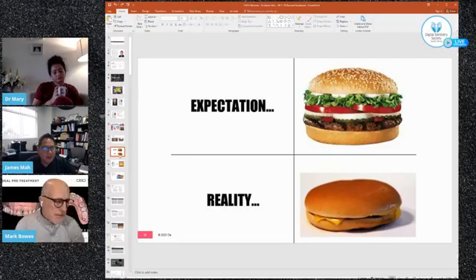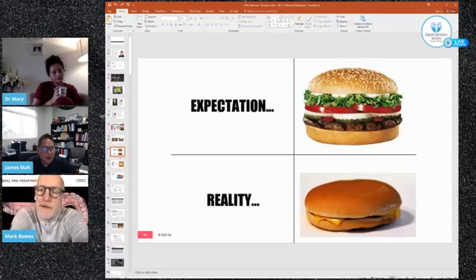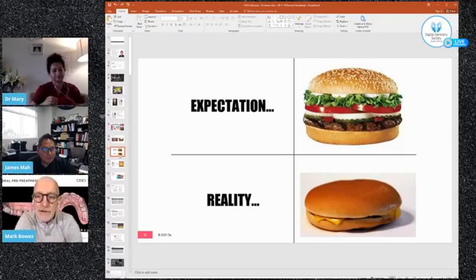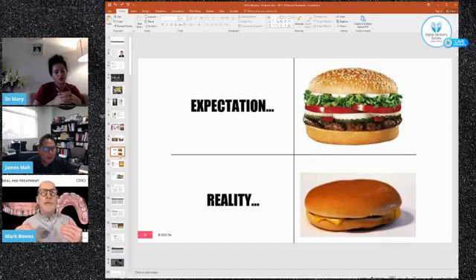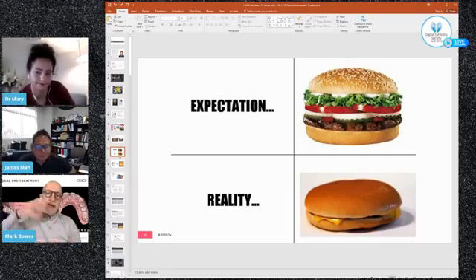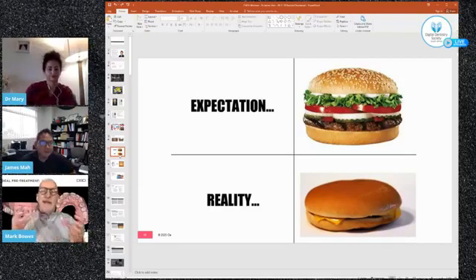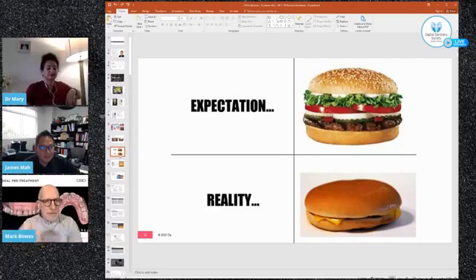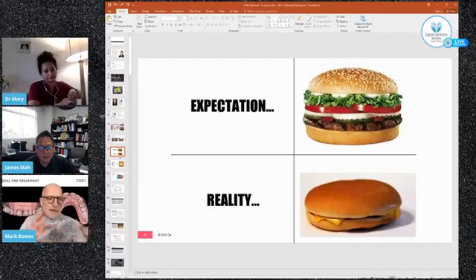Can I ask you, just jump in there, James, because I think it may be an appropriate time to say. Sure. By the way, hopefully we'll get into it, I love aligners. I've been using them for a long time. I've done hundreds of cases. But I think the concept of aligners is a little bit misleading to a lot of dentists, because the fact that you can send something away and get something back means I'm anxious that they think that someone else has taken responsibility for the case. In other words, planning, making a diagnosis, and understanding exactly what it is that we're all trying to achieve. And so I'm sure that you agree that the most important thing before we start any cases is going through exactly the same process that you would for a fixed case from a diagnostic point of view.